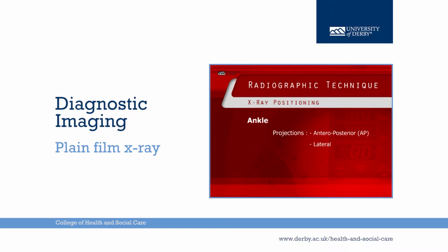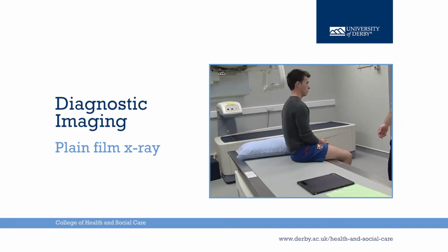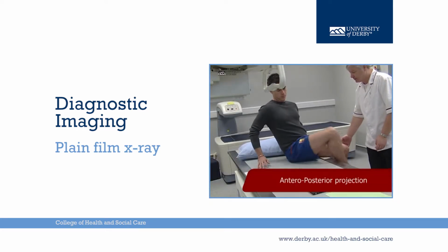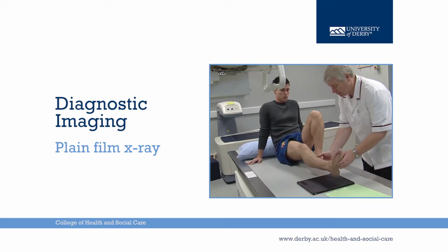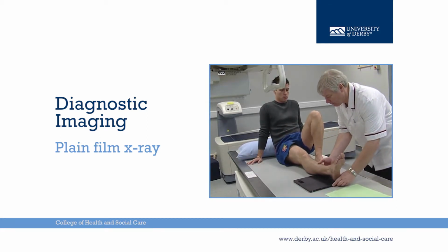The ankle joint. Anteroposterior. Lateral. The anteroposterior projection. The affected limb is extended and the unaffected limb is placed in a position comfortable for the patient.